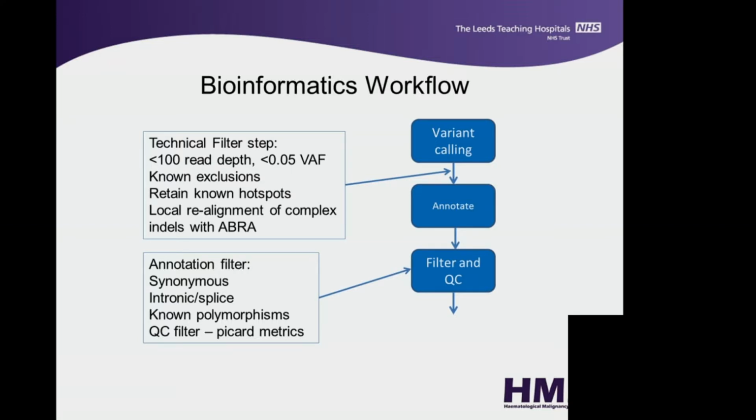We have a series of known exclusions. So these are recurrent variants that you see multiple times in a sequencing run. So you might see that particular variant occurring 20 out of your 48 times. And again, it's a TAQ error usually. So we know what these are, and we find these very, very frequently. So they're technical filters. Again, they occur in the VCF file.